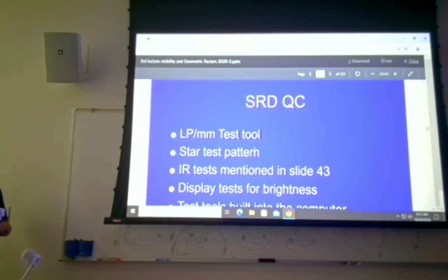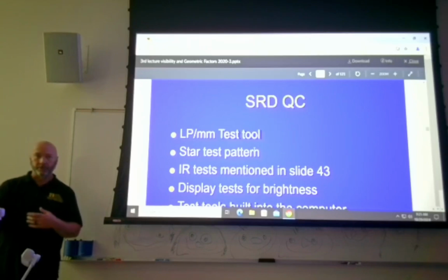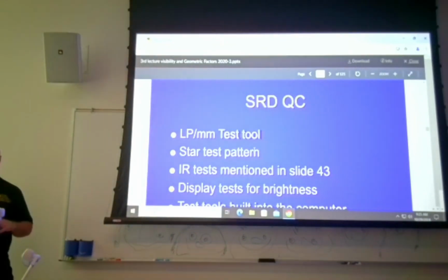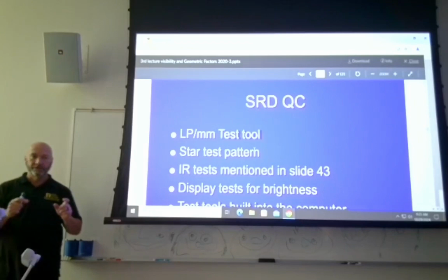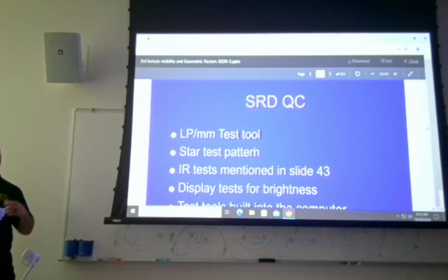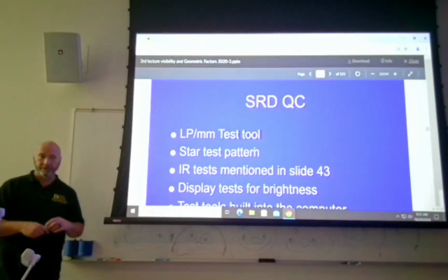So it's not just the spatial resolution, it's contrast resolution as well. The dynamic range is totally different. So the bit depth is a whole lot deeper than what you're seeing on your computers. So, you see an image, the index number looks good, the collimation looks good, everything looks good technically, but the image just isn't quite where you would like to see it. Do you adjust the image and then send that to the radiologist? No, you send the original, because what doesn't necessarily always look good on your computer might look much better on the radiologist's computer.